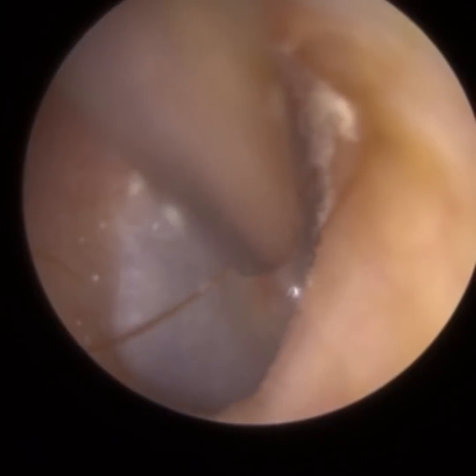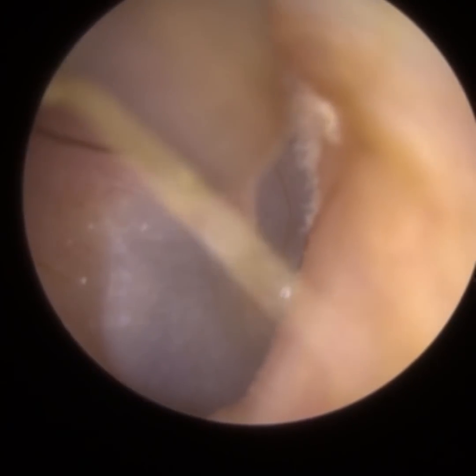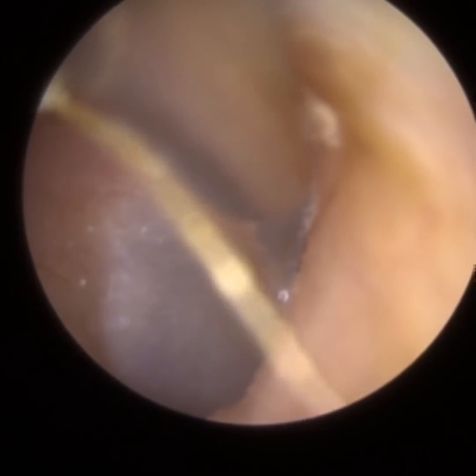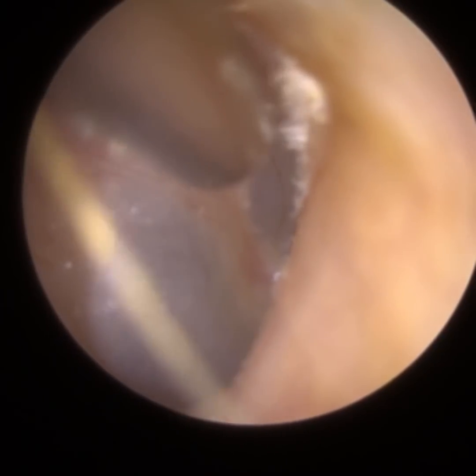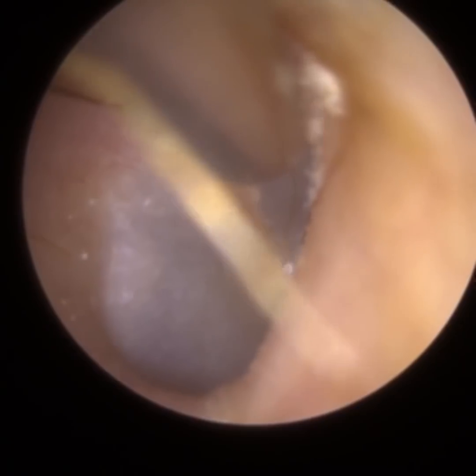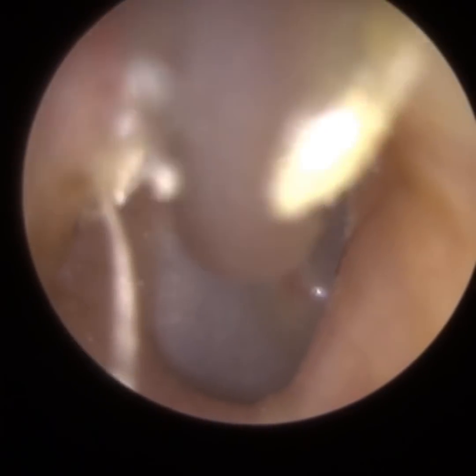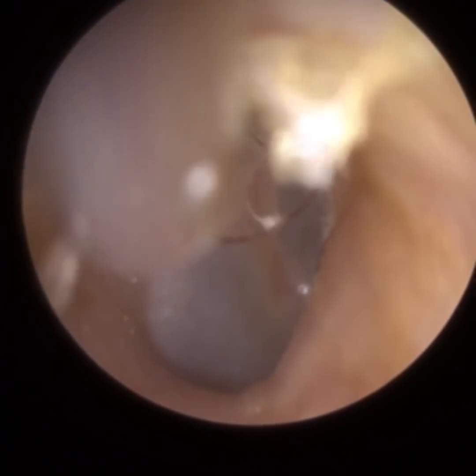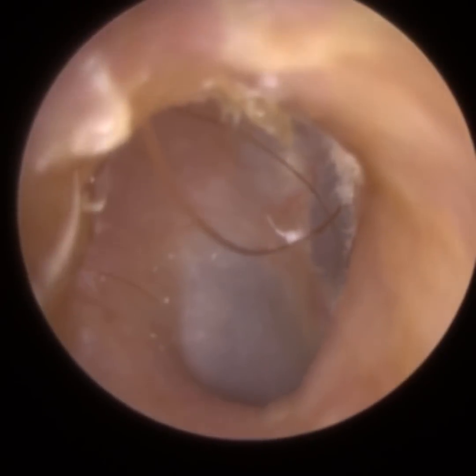So the patient's already receiving treatment for this, or repeat treatment. They've had this in the past. So they've been asked to contact their doctor who will re-prescribe the treatment, some Canesten ear drops, antifungal drops. Sometimes Earcalm, so acetic acid, can also help over the counter. So I'm going to try and get as much of that fungal spores out as possible. It's something that needs to be treated really with medication.